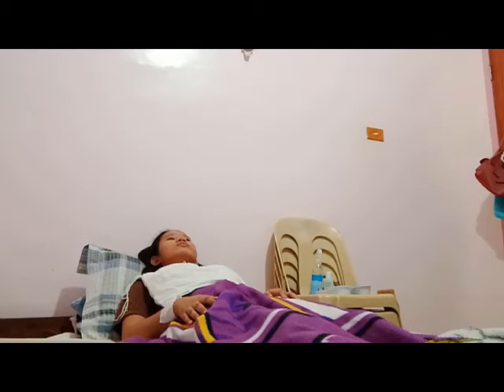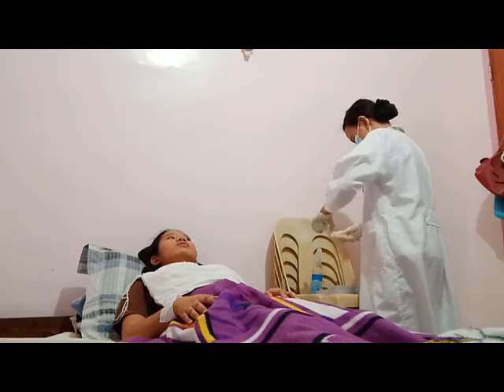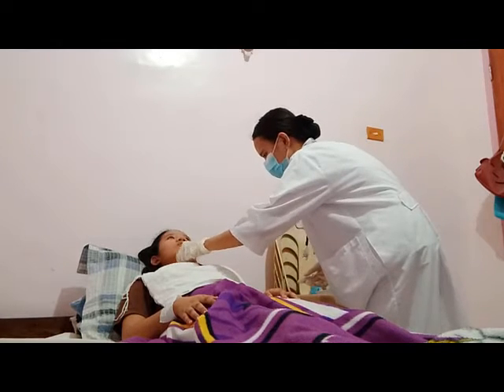Discard gloves and put on another pair of gloves if necessary. Dry the inner cannula using a sterile gauze pad. Gently reinsert it back into the tracheostomy tube. Be sure it is properly locked.